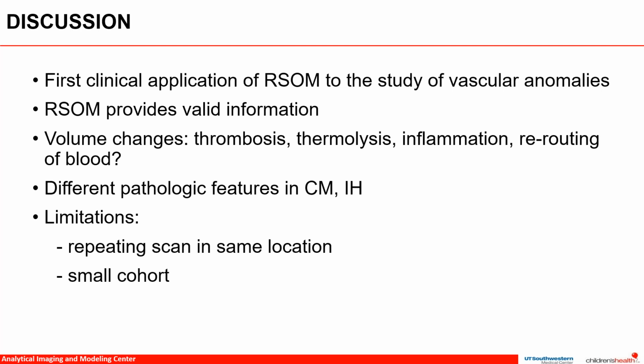Because this is such an innovative technology, more research is needed to develop methods that can be applied in a clinical setting. We noted volume changes in our studies from pre to post-treatment, with an overall increase in volume in capillary malformations and a decrease in volume in infantile hemangiomas. Because these are different pathologies, it's not surprising that they behave differently to the same laser treatment. We're investigating the possible causes of these volume changes that occur immediately upon the conclusion of laser treatment. Given the effect of laser on the vasculature, could these changes be due to thrombosis, thermolysis, inflammation, or rerouting of blood? Some questions still remain, providing future direction for our study.